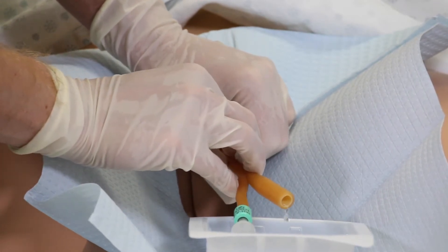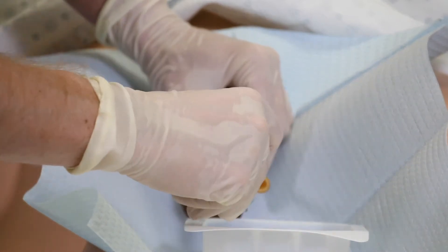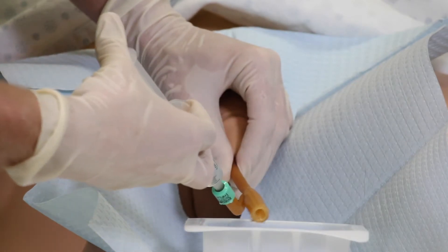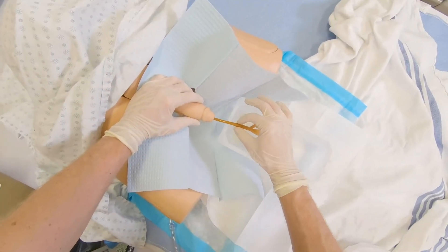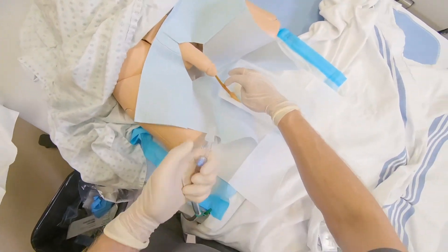Drain the bladder of all the urine. Then inflate the balloon using the syringe of sterile water. Remove syringe and gently pull the catheter until resistance is felt. Then advance back a couple centimeters and attach urine drainage bag tubing to the end of catheter.